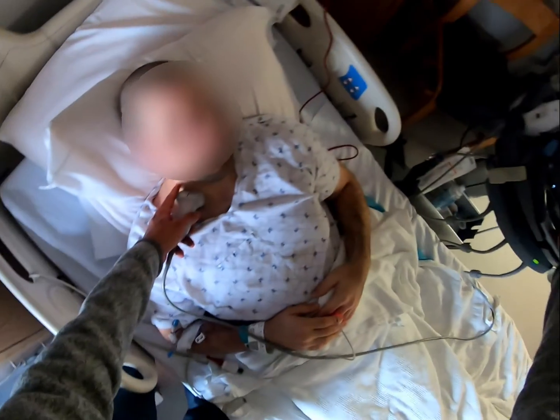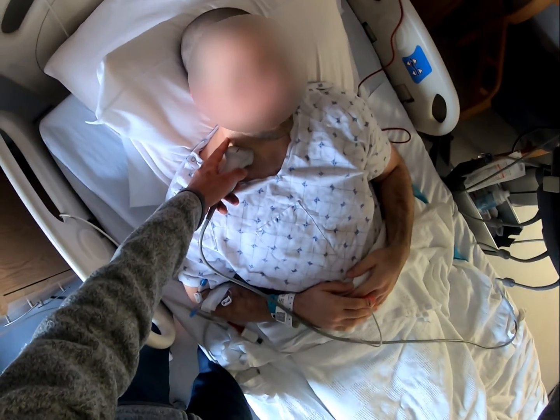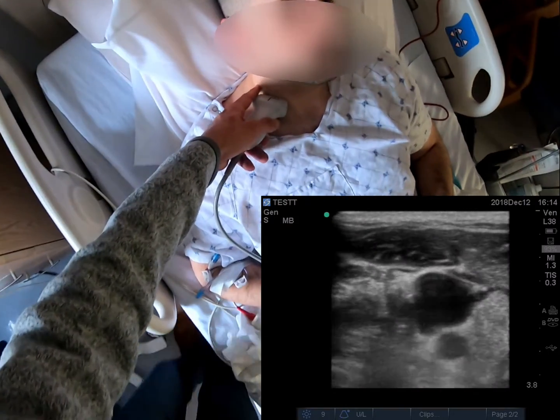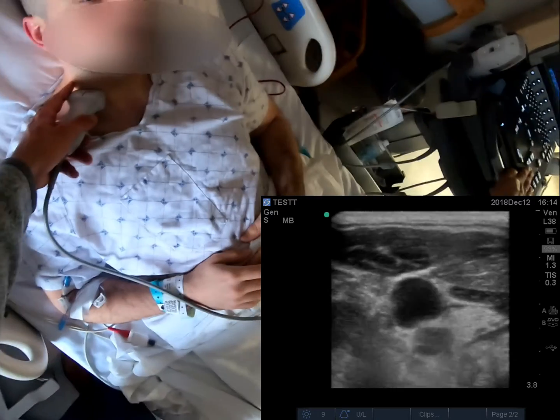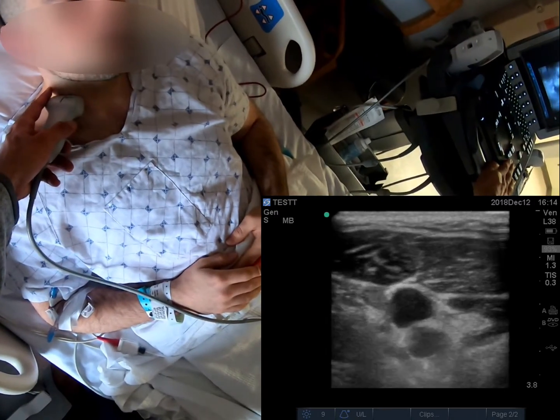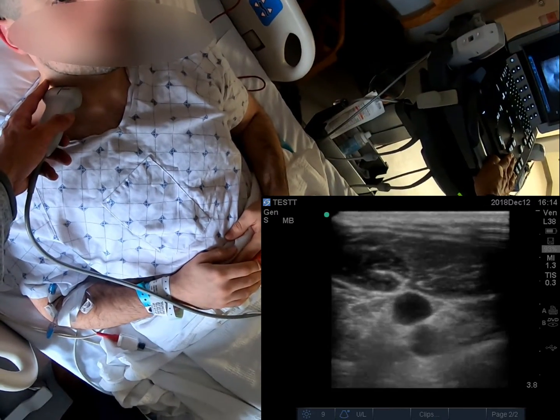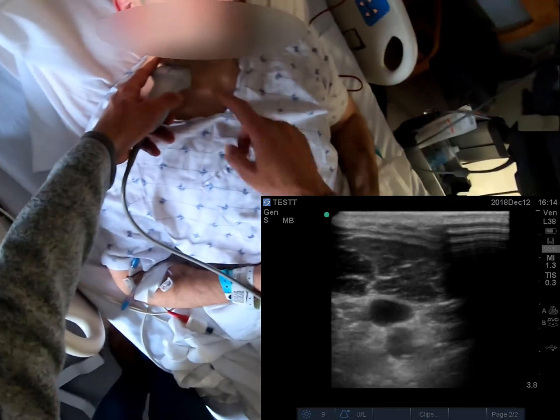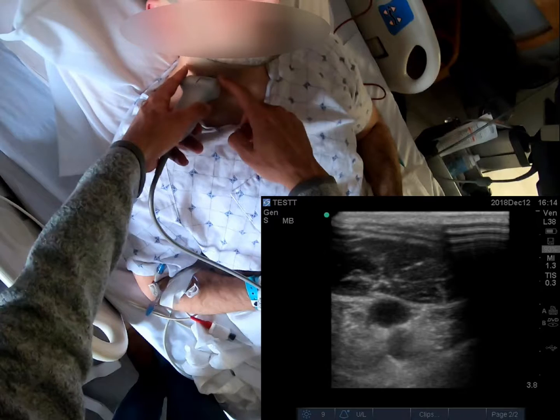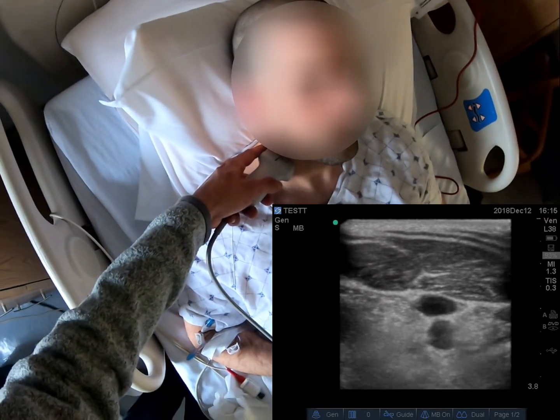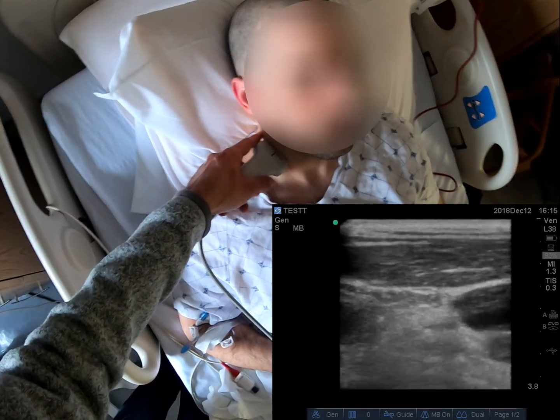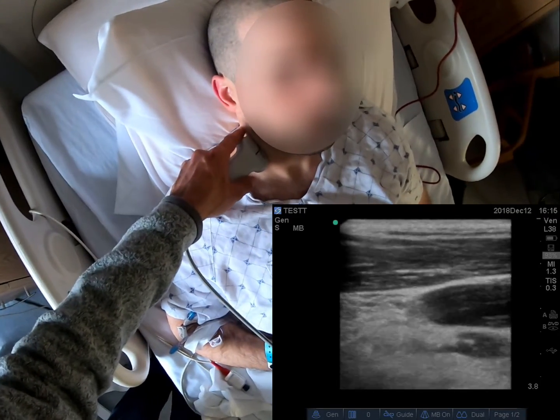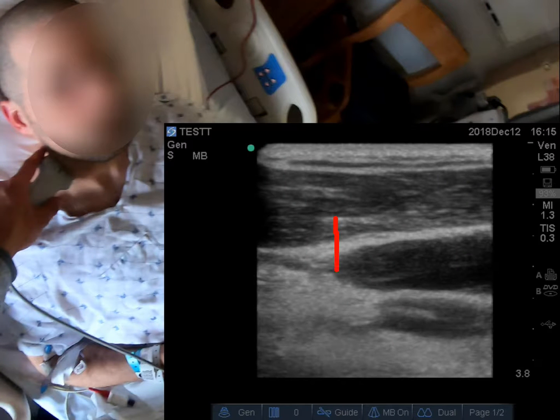Start in transverse view near the clavicle and slide upward until the jugular vein is less plump and spontaneously collapsible. This is roughly the meniscus. Then switch to a longitudinal view. You will be able to see the transition point along the length of the vein.